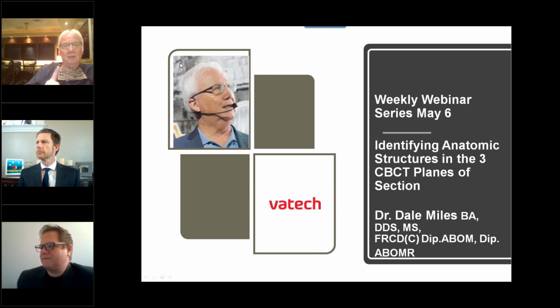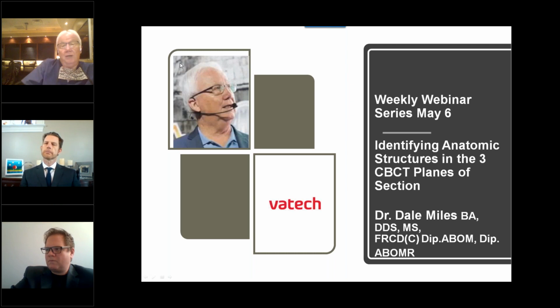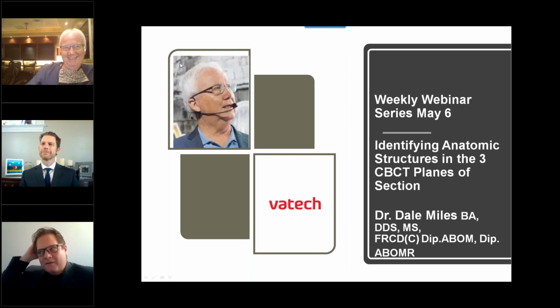There's a distinction. You don't have to diagnose everything that's in a scan, okay? But you have to look. And if you have to look, you have to be able to recognize this is normal, this is abnormal. Abnormal, I need another pair of eyes on it. I need an expert with more skill than I do to look at it. So yeah, if you take a scan, you're responsible for everything in it. That's the whole risk and liability lecture.